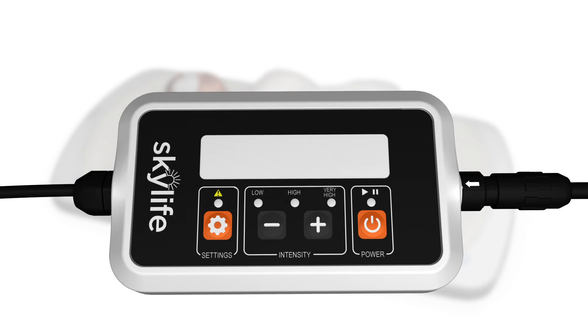You are now ready to begin treatment by turning on the SkyLife device. To power on the device, press and hold the power button on the controller until you hear a beep and the lights come on. The SkyLife device will run a self-test. After the self-test, you may press the plus button to begin treatment. The plus and minus buttons allow you to set the light intensity to the level prescribed by the clinician, who will order a low, high, or very high level.